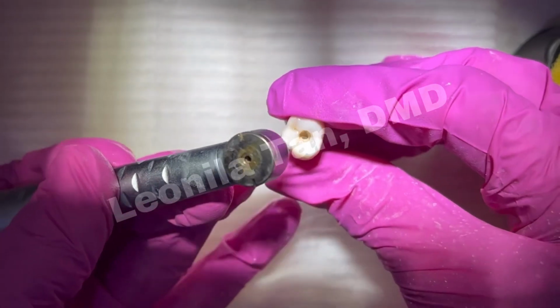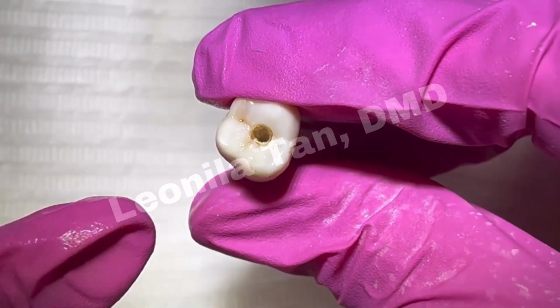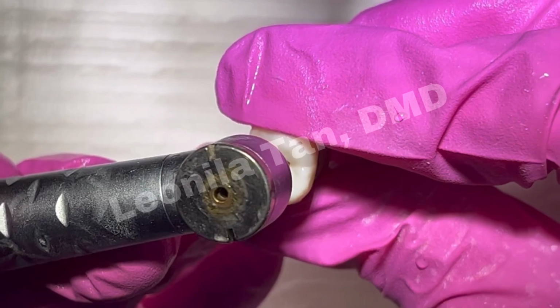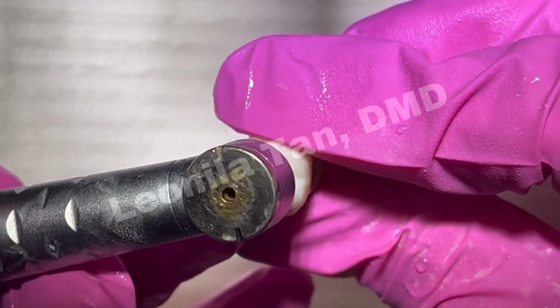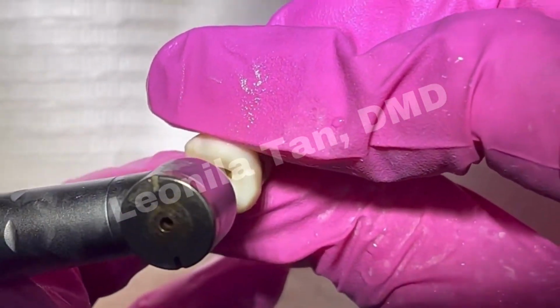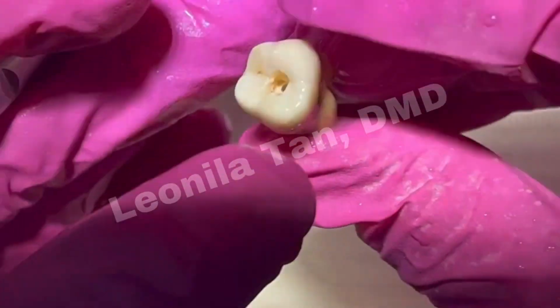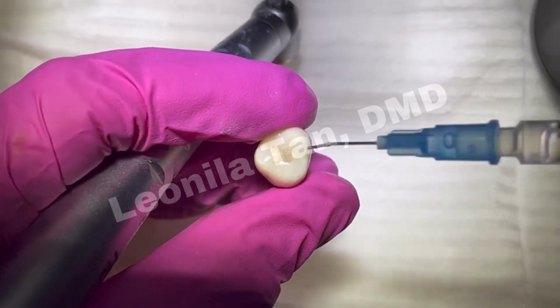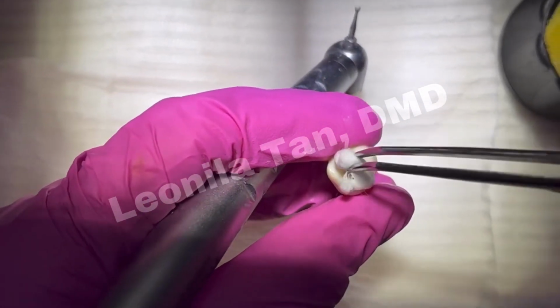Since we've located the distobuccal and the palatal canals, we now look for the mesiobuccal. So we burr now very slowly, going to the mesial side, again opening up areas where you feel undercuts. Then let's check. Irrigate. That's always your sequence. You always want a clean area.